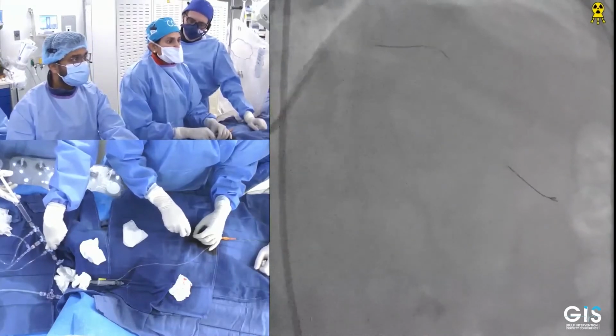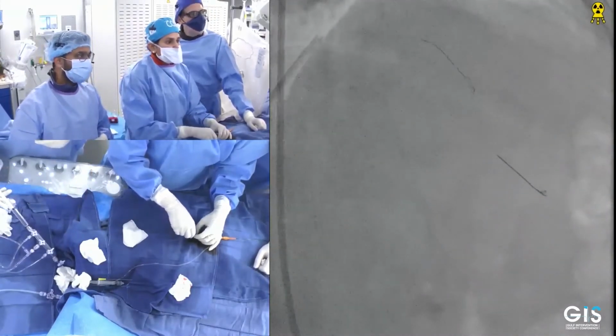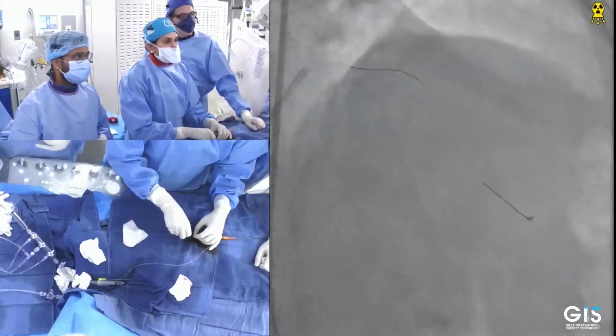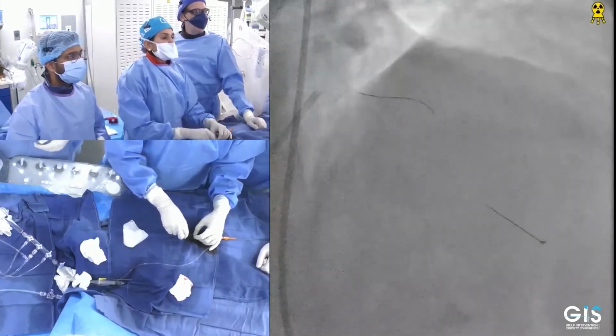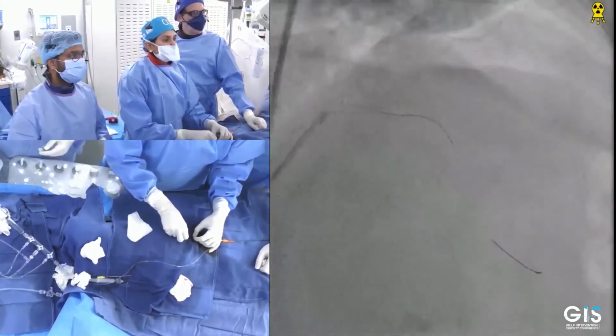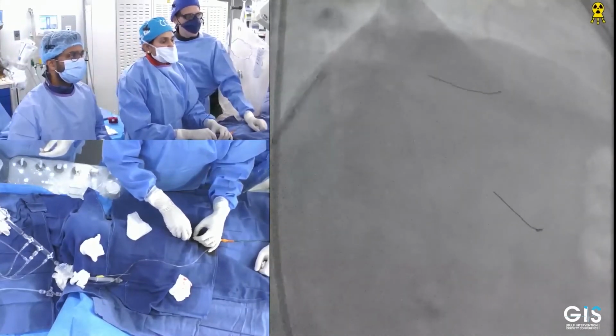I don't know why the wire was thrown. We lost the diagonal wire. What happened? We missed that. The wire was entangled with a high pressure balloon. Pulled the wire back a little bit. But again, there is no lesion in the ostium of the diagonal. So rewiring is again easy, but is limited by the many branches that exist here and there.